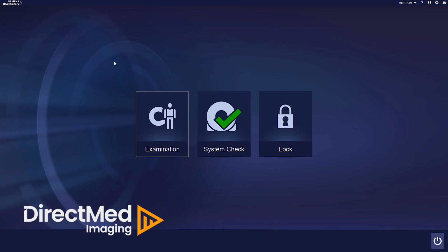You should never change your date and time if there are any ongoing examinations. You have to also be mindful of changing your time in the past. If you made a recent scan and you're changing the time backwards into the past, it's possible you could influence the tube load calculator and disable your system until that appropriate time that you went backwards in the past has elapsed.